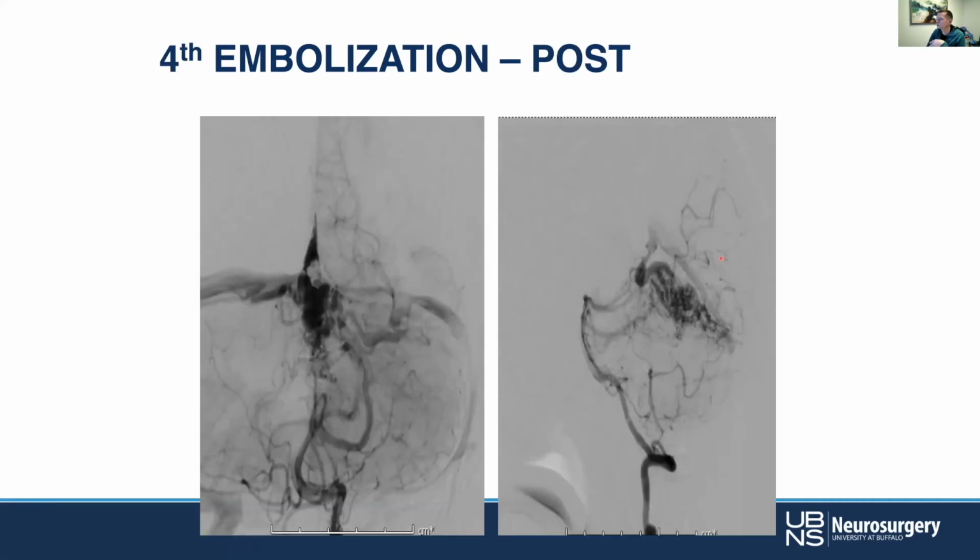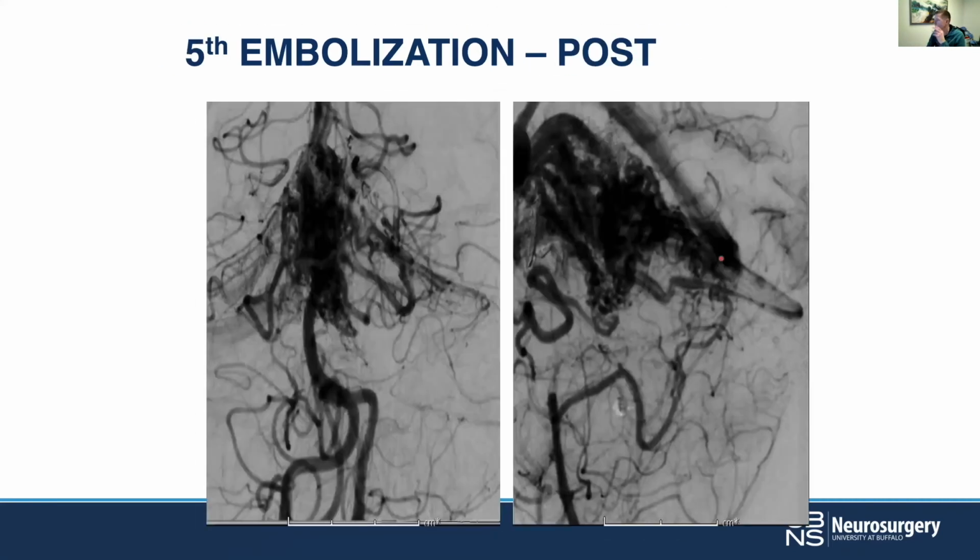We do this multiple times, 4th, 5th embolization. All right, so this is the result of our 5th embolization. There's still substantial nidus. We've taken all these small feeders that we can. We don't have a good arterial pedicle. These are all off thalamoperforators, so high-priced real estate. What are you going to do? Options, surgery, absolutely. That's definitely an option. This is in a pretty good location for surgery. The cerebellum is very tolerant to transgression, so it shouldn't be a problem.